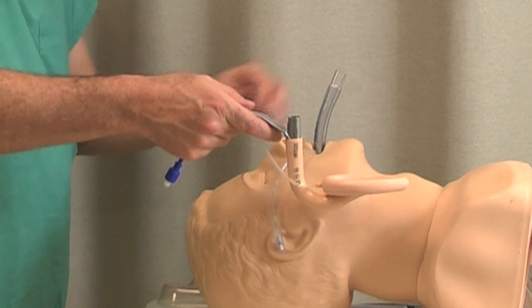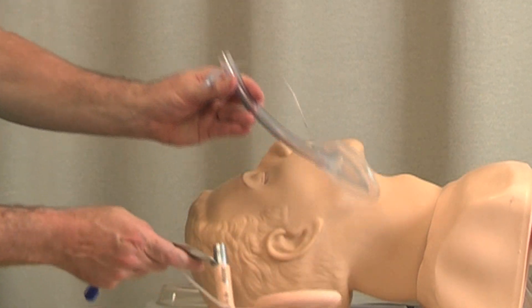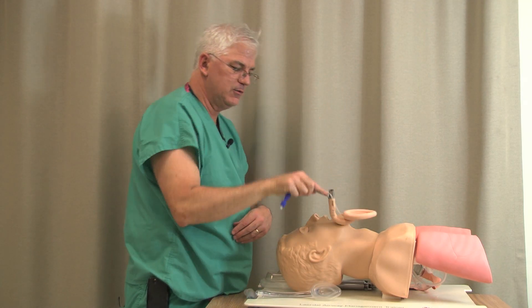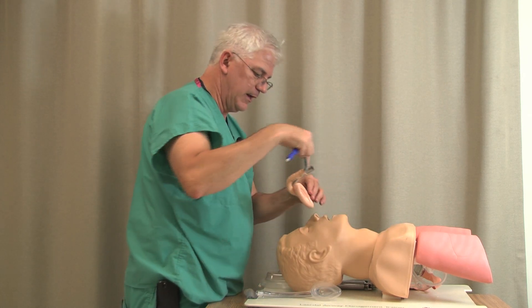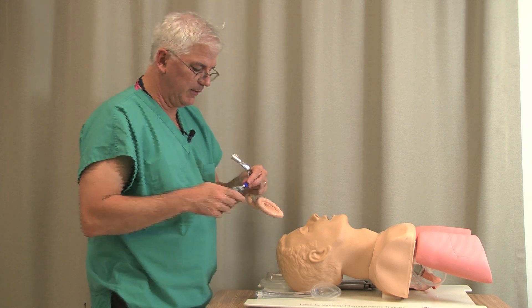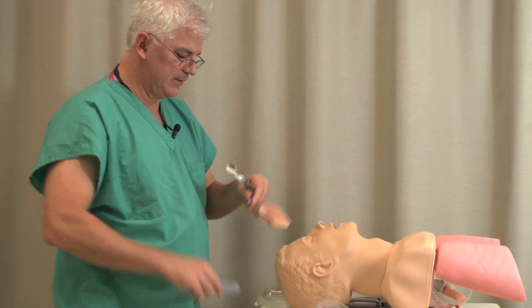This is an intubating LMA versus a regular LMA. With an intubating LMA, you put it in like this and then turn it like that, so you can imagine how it would be sitting there. The intubating LMA is a little bit harder to put in — a little bit more klutzy when you put that thing in.